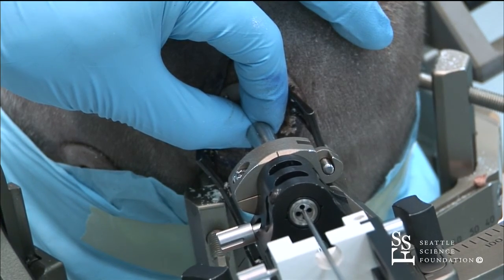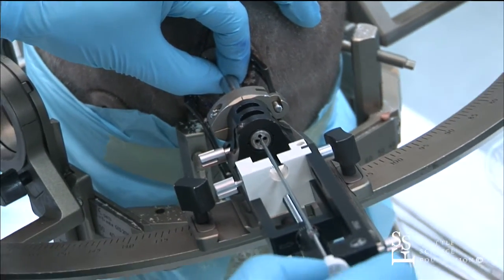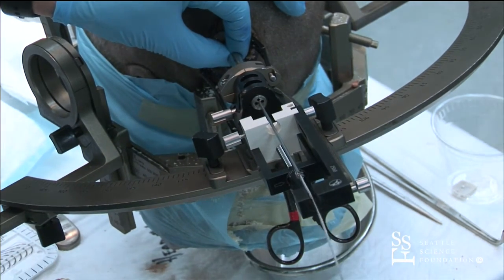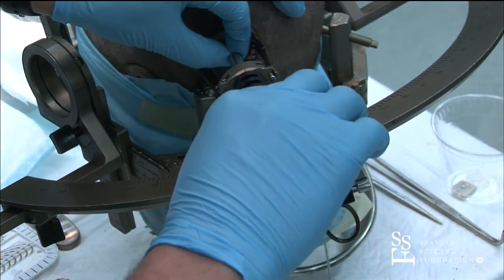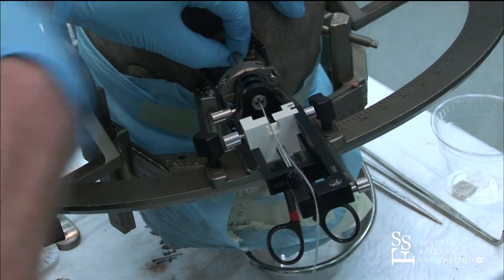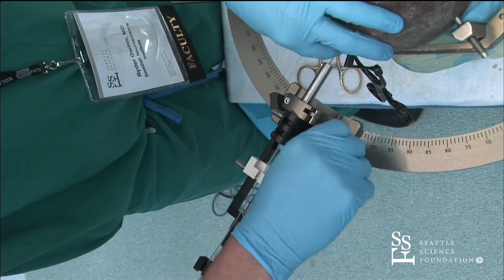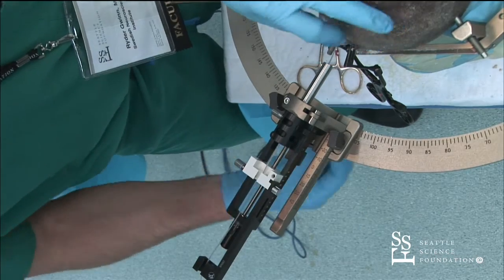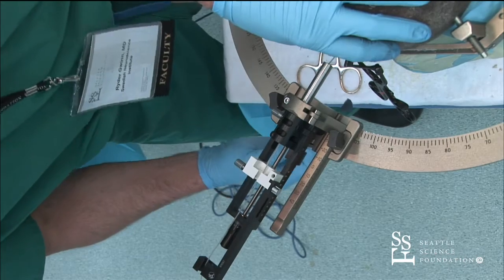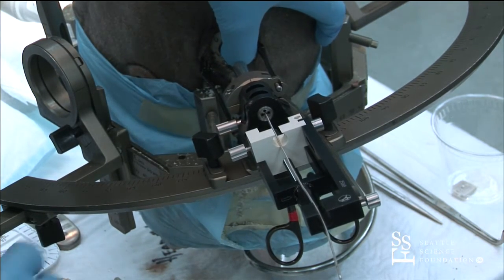So we'll take out the stylet, and we'll take out the stop. And take out the cannula. And then you can slide this up to get a little more working room if you need to. And then typically I get a Penfield 4 and hold it over on the side while somebody else puts in the stop.